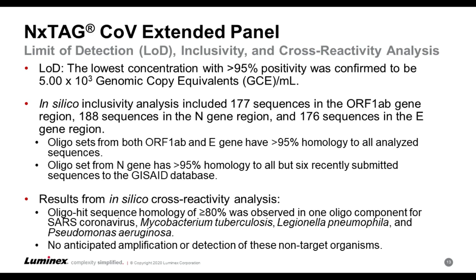As far as the in silico cross-reactivity analysis goes, we were able to show over 80% homology with a few pathogens listed here: Mycobacterium tuberculosis, Legionella, as well as Pseudomonas, and SARS, or SARS-1. However, no amplification or detection of these non-target organisms is expected.